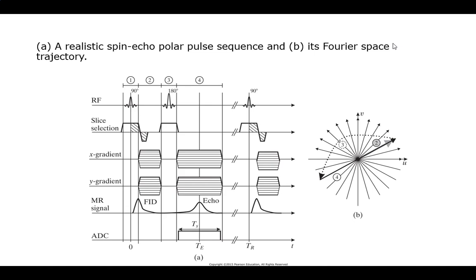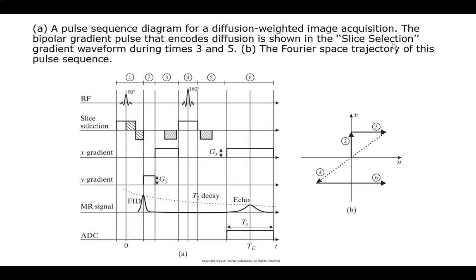Right? And you're maintaining it because that is your sampling period. So you can see my ADC on. And then I'm up here, so I've got to let it decay or potentially hit it with a Z thing to speed it up, if that will be beneficial to me. And I'll walk through different patterns of the XY gradients to basically give you different slices as I'm reading through them. Okay, good? Yay. I think we're getting pretty close to the end. Okay.